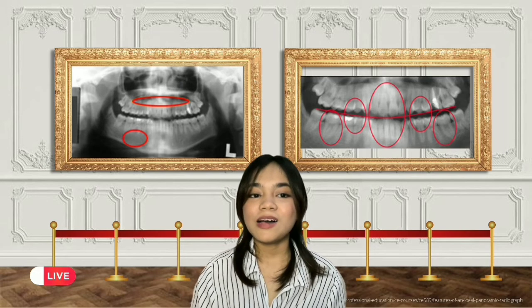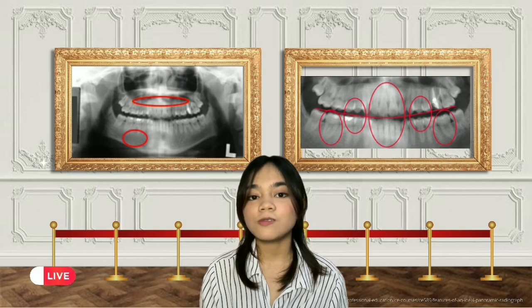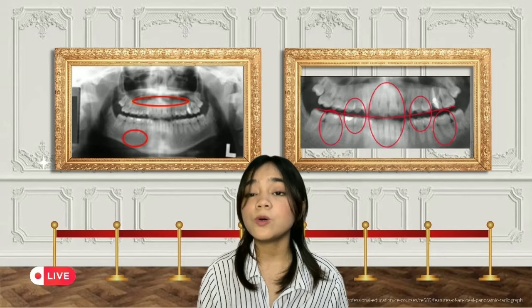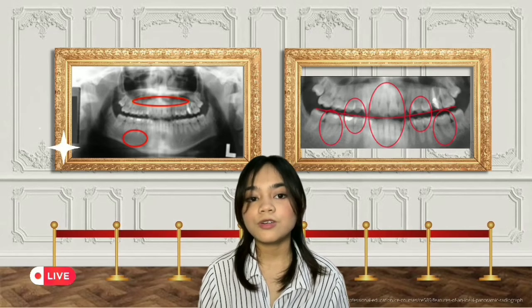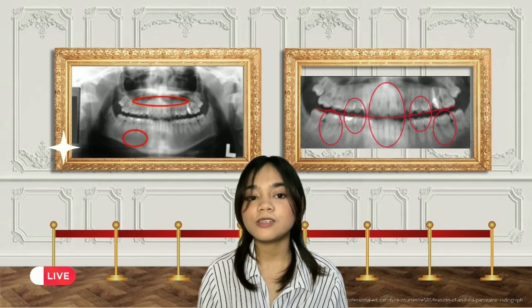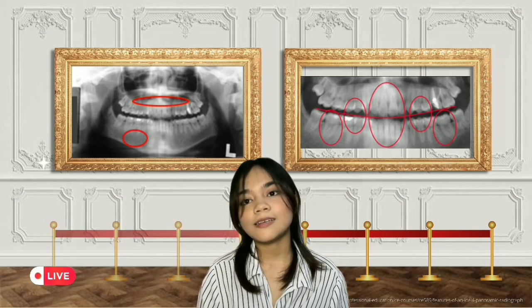On your left naman, we can use the condyles, which should usually be in the upper outer sextant and at the same level. So the right and left molar teeth should be equal in their mesiodistal dimension. The density across the image should be uniform with no air shadow above the tongue, creating a radiolucent band over the roots of the upper teeth. The image of the hard palate should appear above the apices of the upper teeth, and the ramus width should be very similar on both left and right sides.